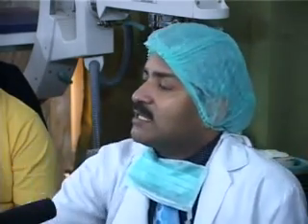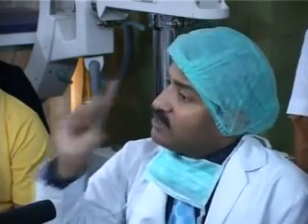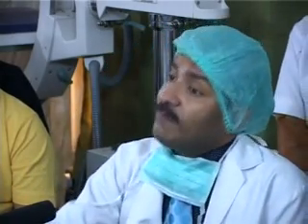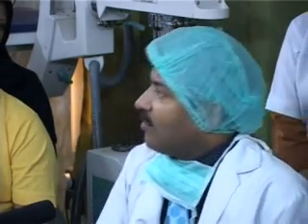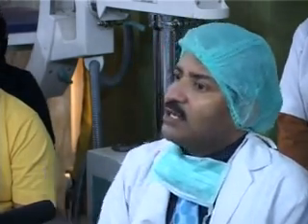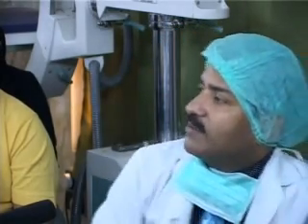Now in abnormal circumstances, it may be 100 liters. Like when all the washers are wrong and leaking, your port size is not good, your instruments are 10 years old, there is a leak everywhere, and your insufflator is pumping gas anyhow. Within 1 hour you have used 100 liters. And it may be very bad for the patient, because the patient has more risk of dryness of the bowel, more risk of adhesion, and more risk of hypothermia as well. So this way the insufflator has to be kept in mind.